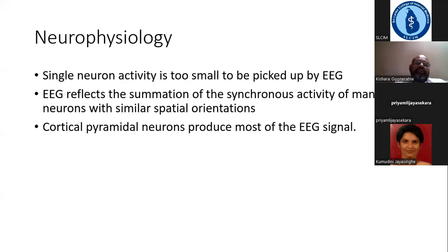EEG signals and EEG alone without clinical context is actually quite useless. And therefore, EEG needs to be interpreted with clinical context. And when interpreted with clinical context, then EEG becomes a very useful tool.